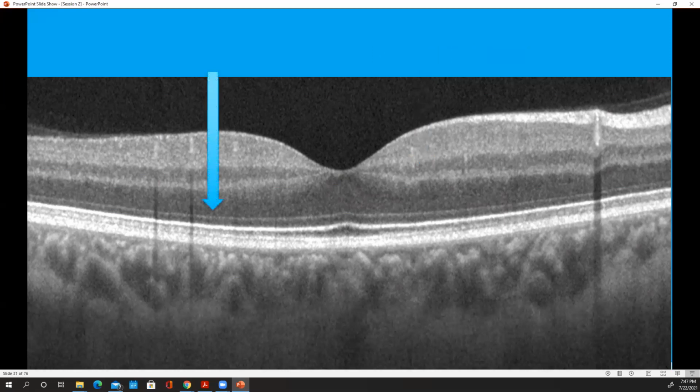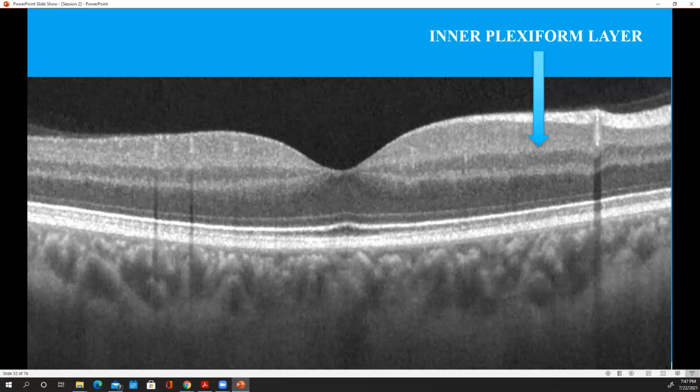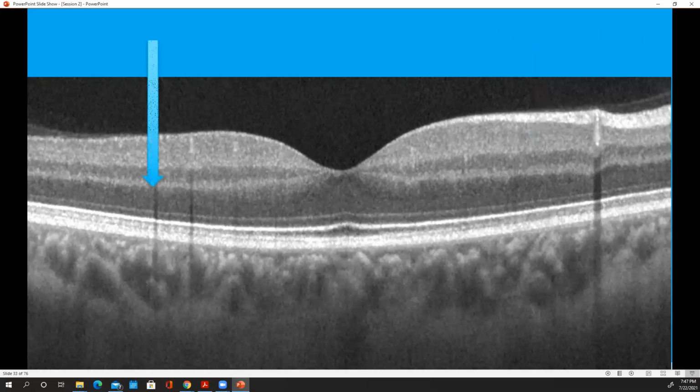All right, so let's go to this one. That's outer nuclear layer. Dark layer, nuclear thus, and outer, outside the club. Okay, how about that one? That's inner plexiform layer. Yep, and you got plexiform because you knew light layer, axonal, a lot of reflectance, anything that's densely packed. And in our retina, the thing that is densely packed are plexiform layers, anything that deals with bundles of axons, almost like a cable that has a bunch of cables inside of it. Inner plexiform layer.